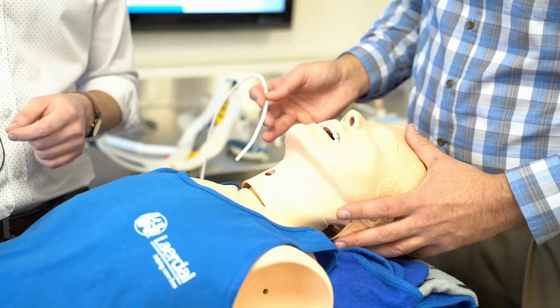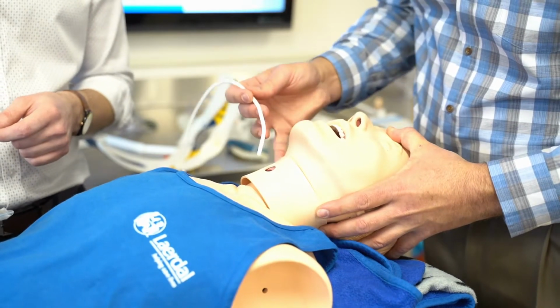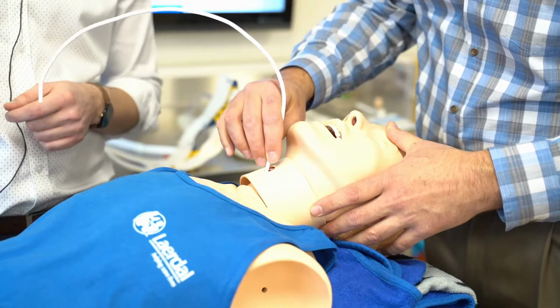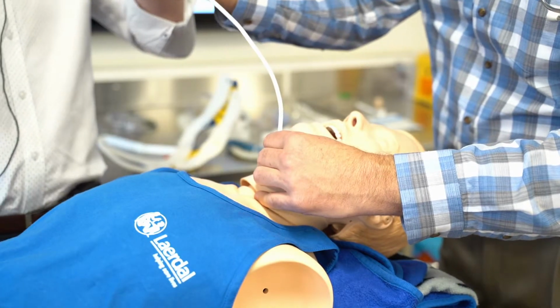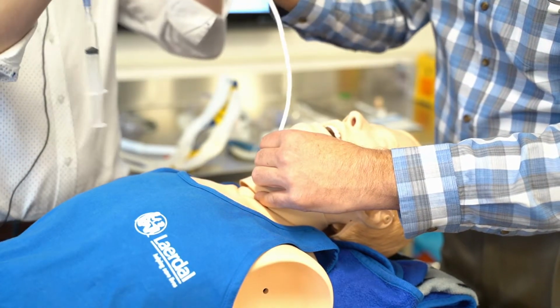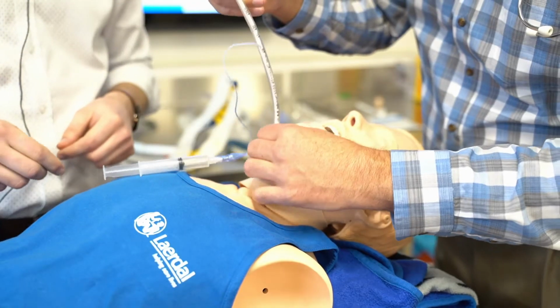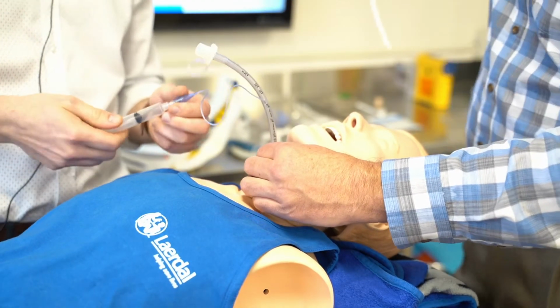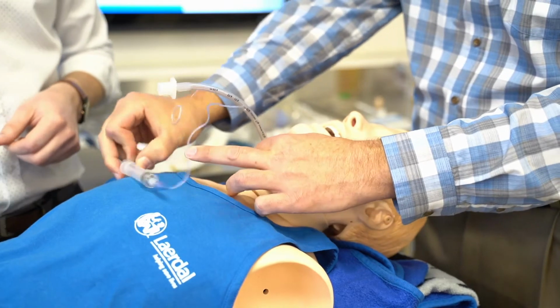Now to facilitate this, we're going to go ahead and use a bougie. Pete's going to insert the bougie and feel for tracheal rings or a hang up to note that we're in place. Following that, we're going to use a 6.0 inner diameter tube and secure the airway. Once the tube is in place, we're going to go ahead and inflate the cuff and use our end-tidal for confirmation.